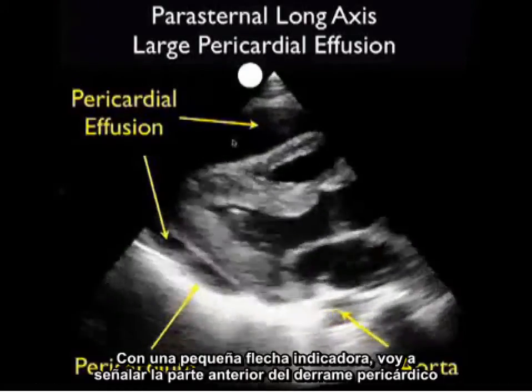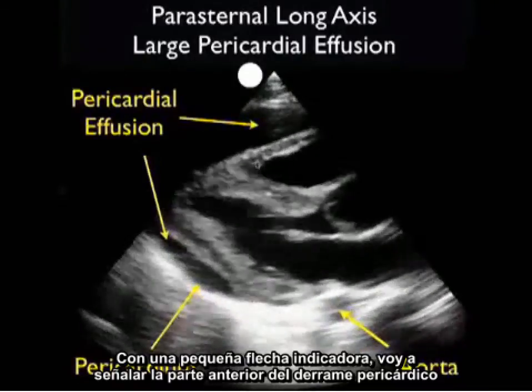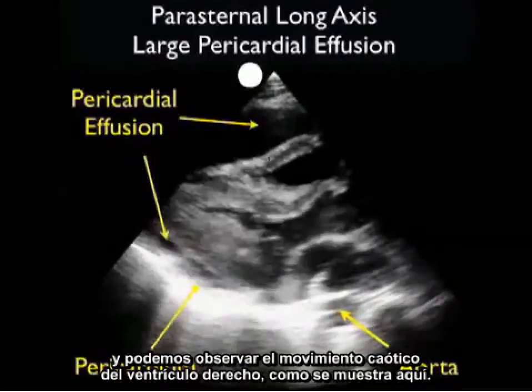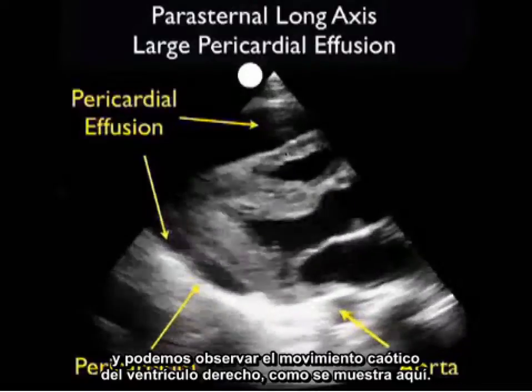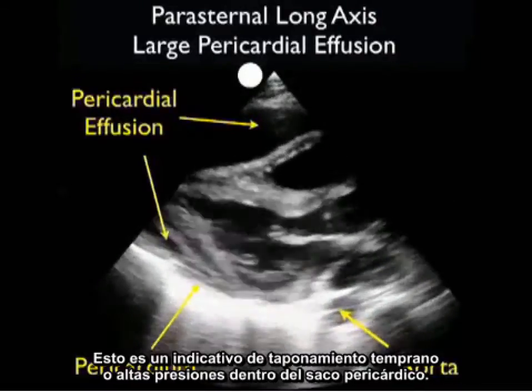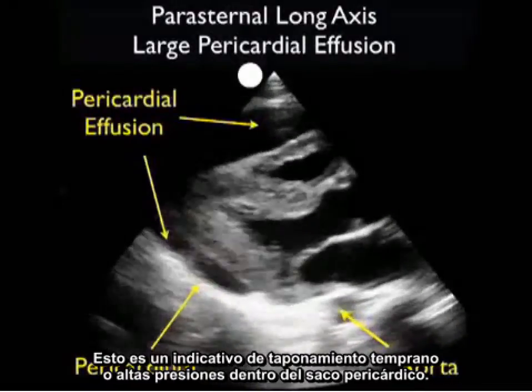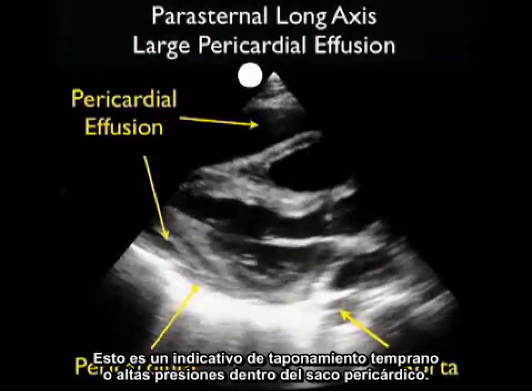The pericardial effusion comes anteriorly to surround the heart. With a small indicator arrow I'll point to the anterior portion of the pericardial effusion and note the chaotic movement of the right ventricle as shown here. This is indicative of early tamponade, or high pressures within the pericardial sac.